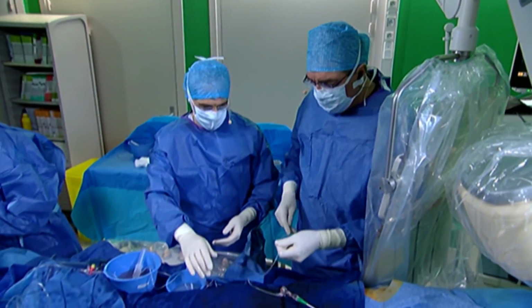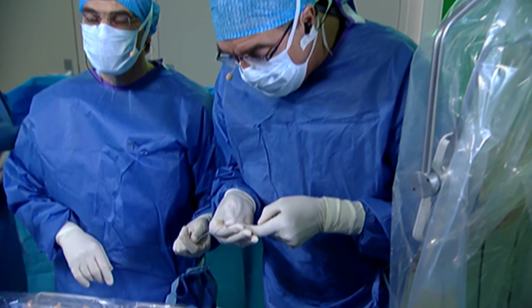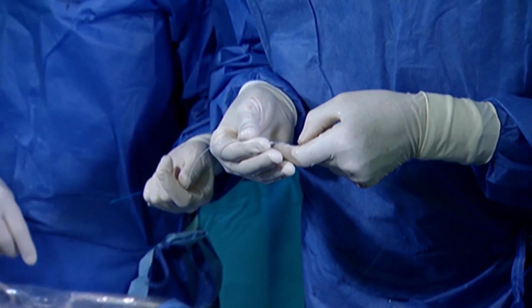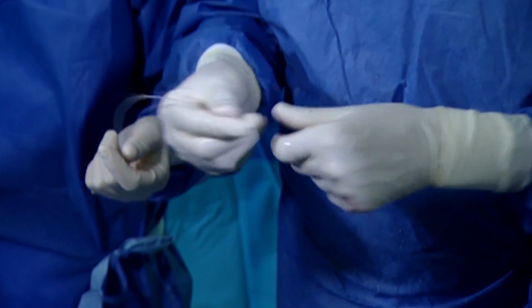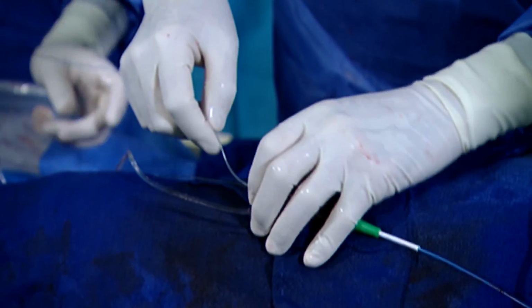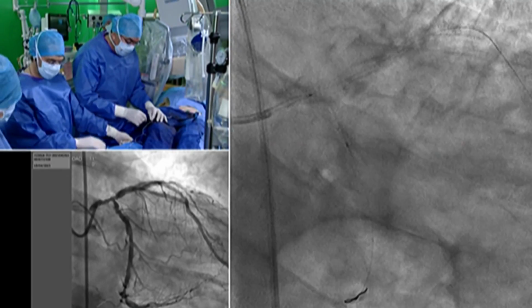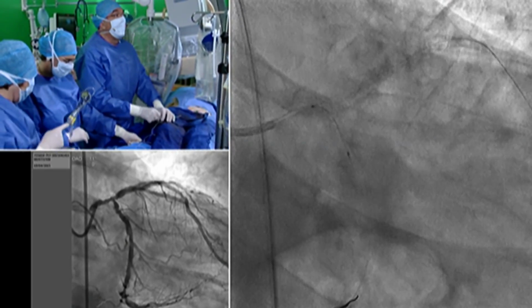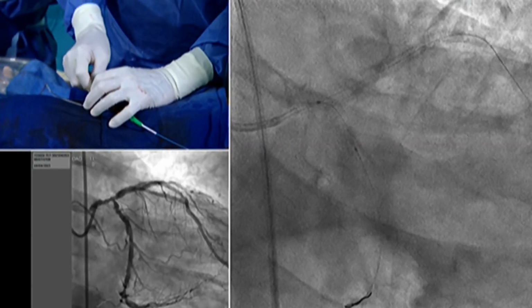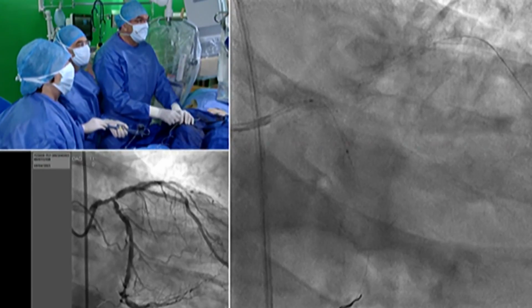Okay. So 4.0 balloon. So now we do the kissing with the 4.0 in the left main LAD, and 3.5 in the left main LCX. Both of the balloons are non-compliant, and so we hope that the result will be fine. Okay, so the 4.0 is coming.